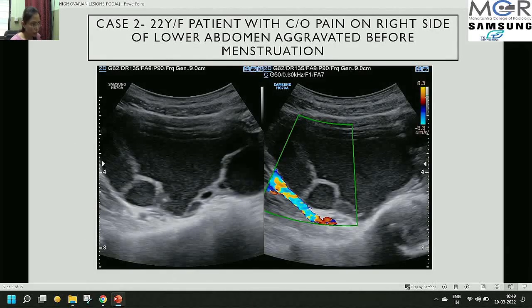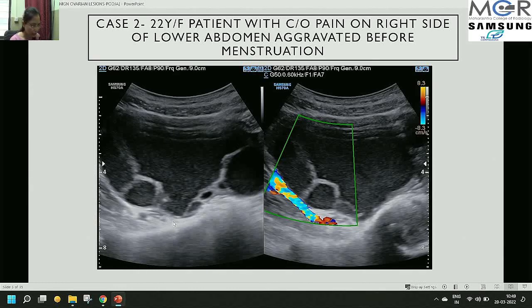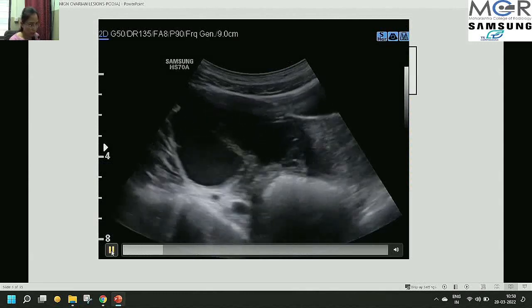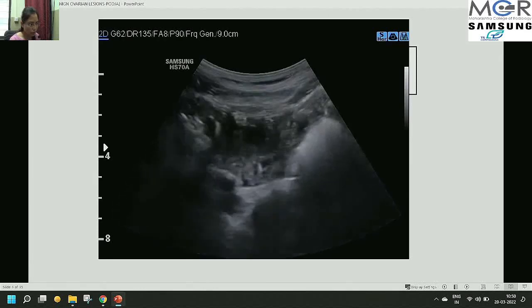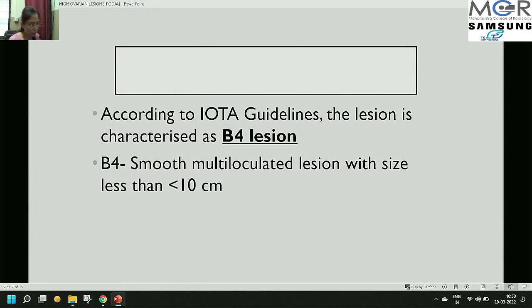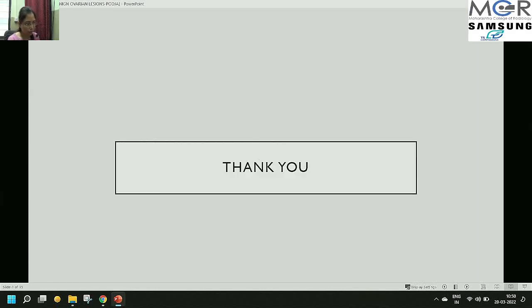Case 2 was a 22-year-old female who came with pain on the right side of the lower abdomen aggravated before menstruation. A well-defined multiloculated lesion was seen in the right adnexa with multiple septa, homogeneous ground-glass type echoes throughout, and no vascularity on color Doppler. According to IOTA guidelines, this was characterized as a B4 lesion — a smooth multiloculated lesion less than 10 cm — and it turned out to be an endometrioma.